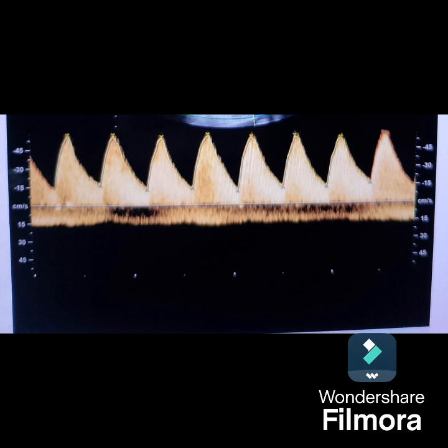Now when will you deliver this earlier? At 34 weeks. That is, Doppler is normal, but still you have to deliver at 34 weeks if there is static growth. Growth scan is done every week, and if there is no growth for 3 consecutive weeks, then it has to be delivered at 34 weeks after giving steroids.